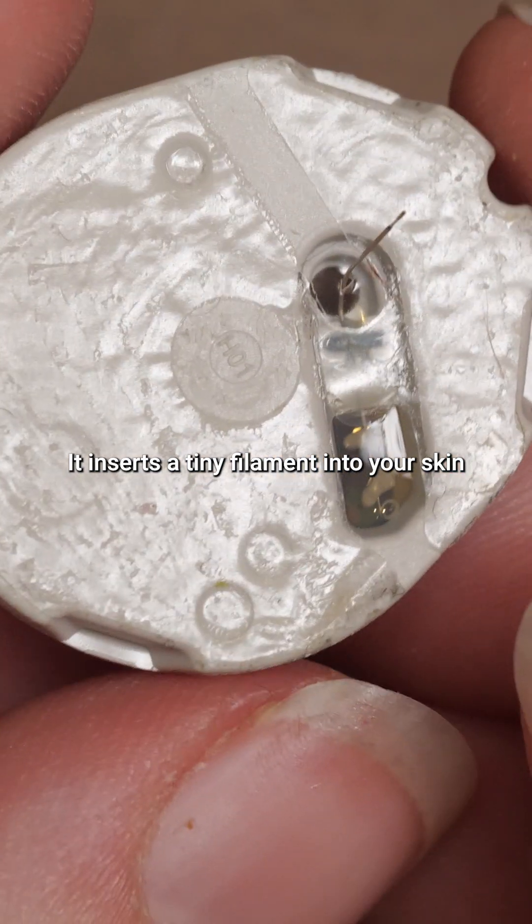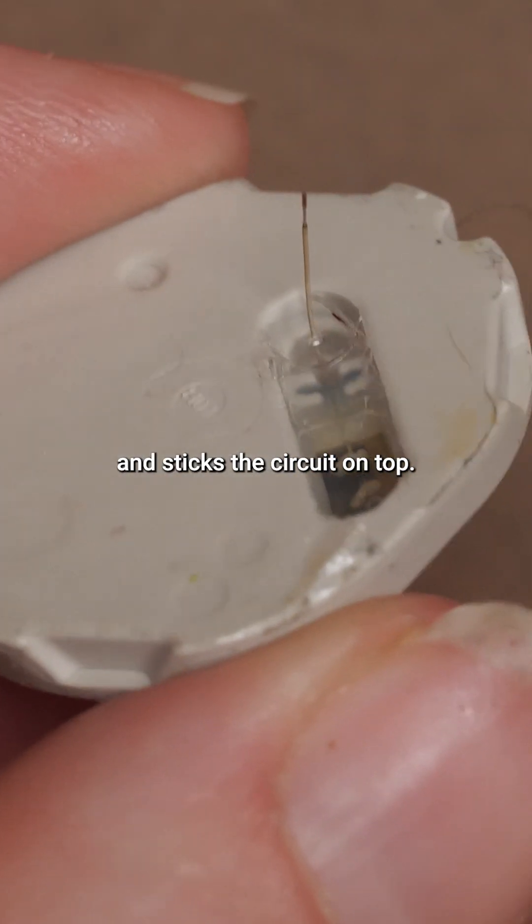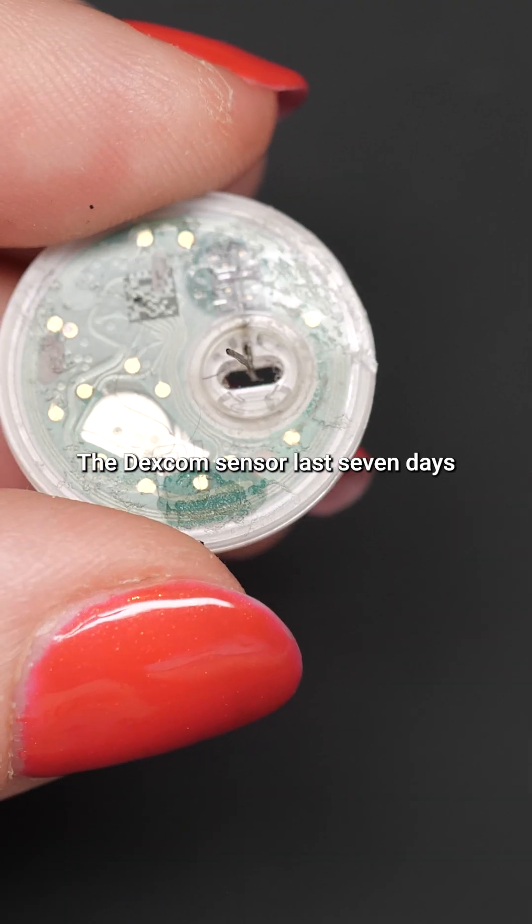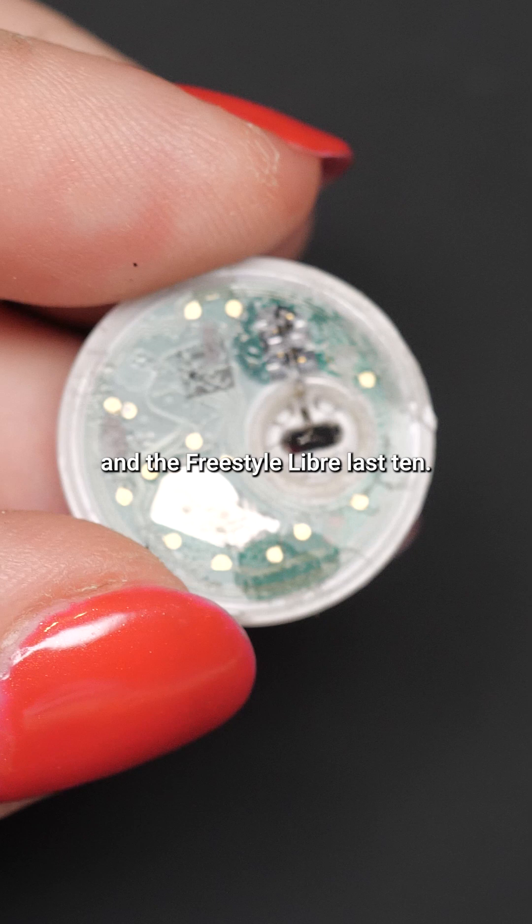It inserts a tiny filament into your skin and sticks the circuit on top. The Dexcom sensor lasts 7 days, and the Freestyle Libre lasts 10.